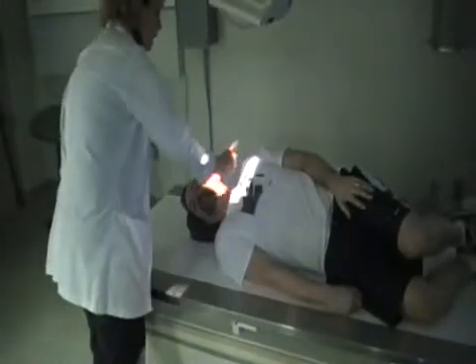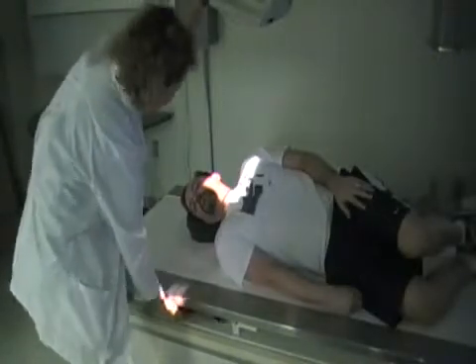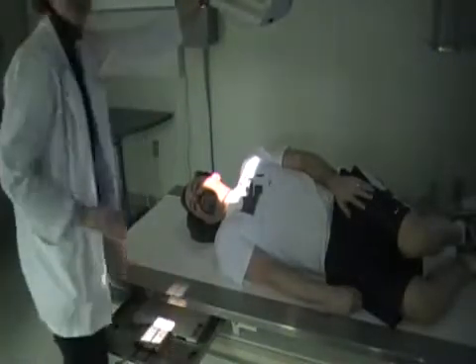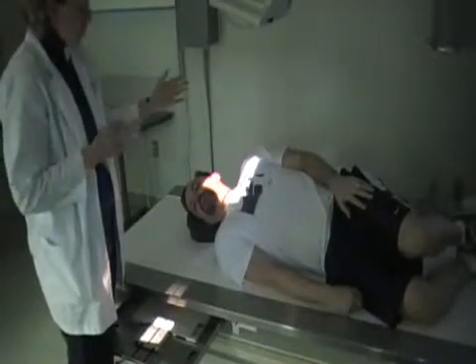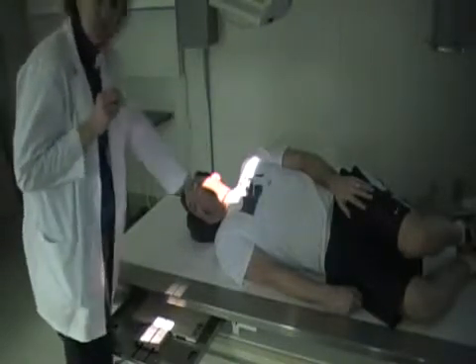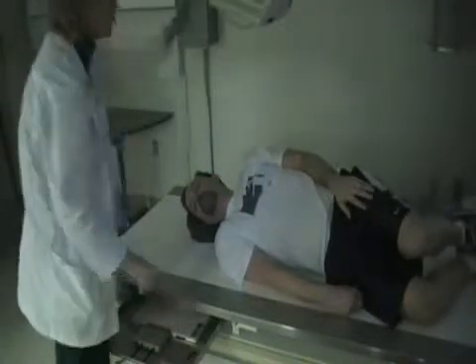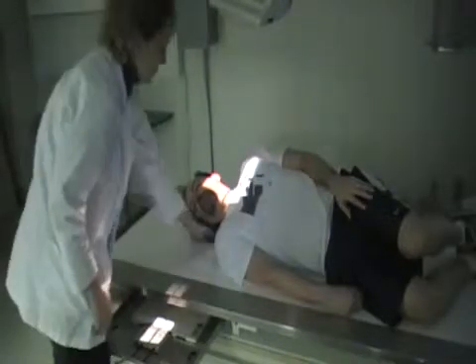Okay, there's the thyroid cartilage. Always want to look at that, and then make sure that this transverse line is in the mid-neck there. So that is our AP axial, since it is the AP oblique, that is, and once you have your patient turn, double check your marker. Since he is to his right side, you're going to mark the right side of the image receptor, or you can place it the right side of the neck.